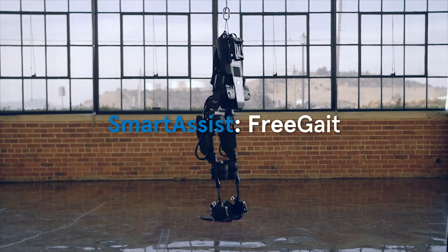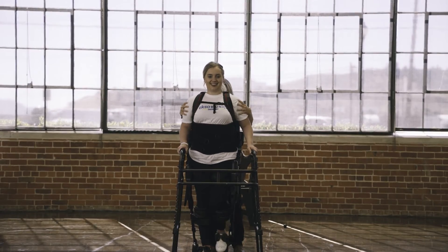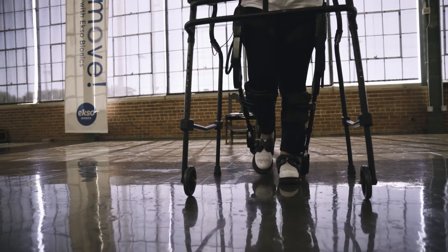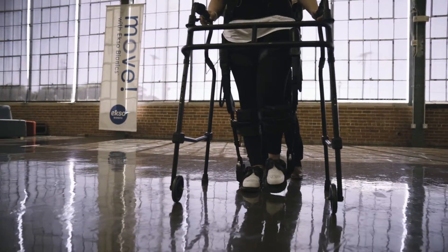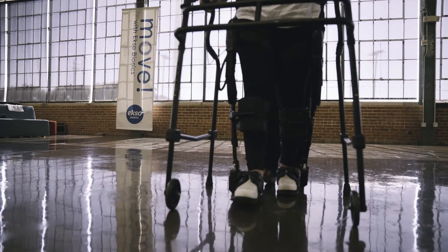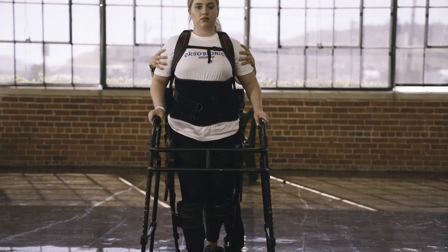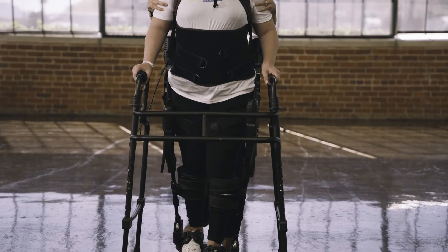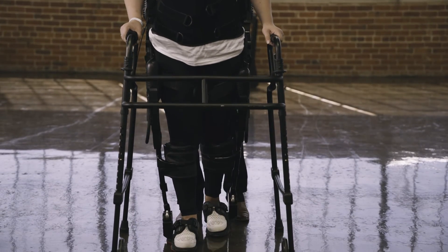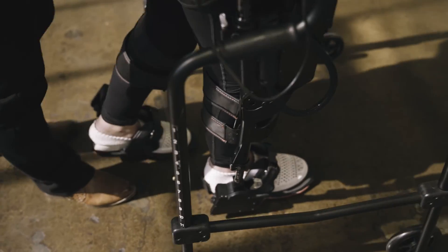Free Gait mode allows the PT to take the robotic trajectory or path off the legs, but allows for stance support to be set for the hip and knee. In this mode, there is no longer a gait path to follow. The patient is able to use any gait pattern they would like, and the PT is able to add assistance or resistance to one or both legs, or let them remain neutral without any assistance or resistance. This allows the PT to customize their treatment depending on their goals and the patient's presentation.